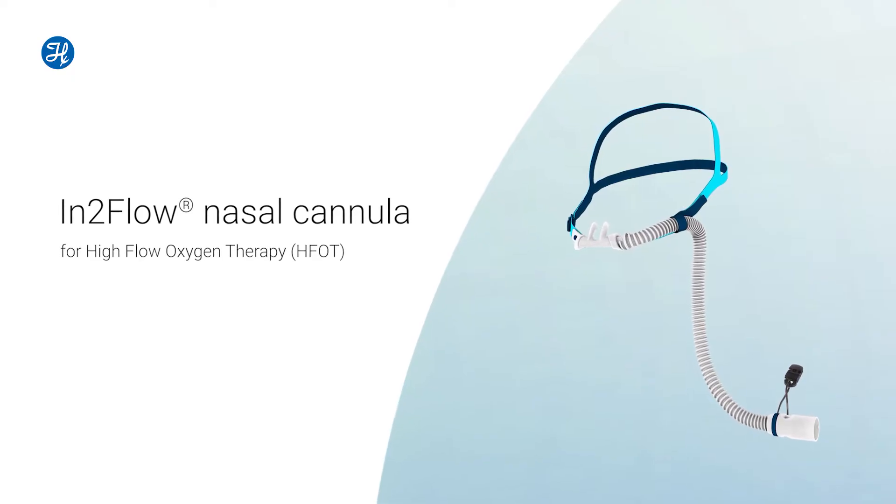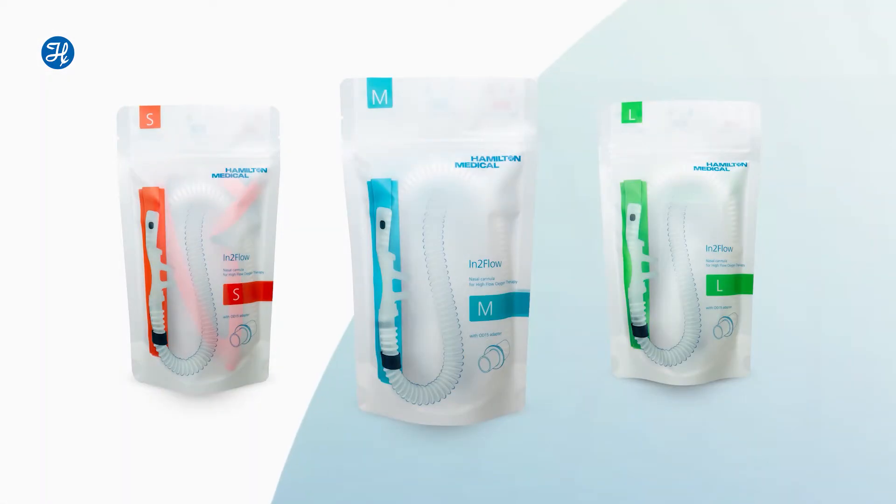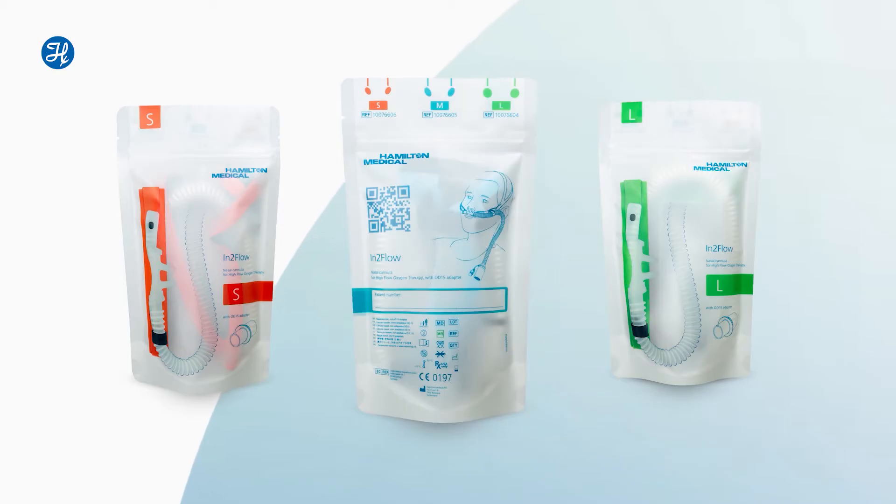Our N2 flow nasal cannulas for high flow oxygen therapy are available in three sizes. Each size has a slightly different anatomical design and allows a different maximal flow.